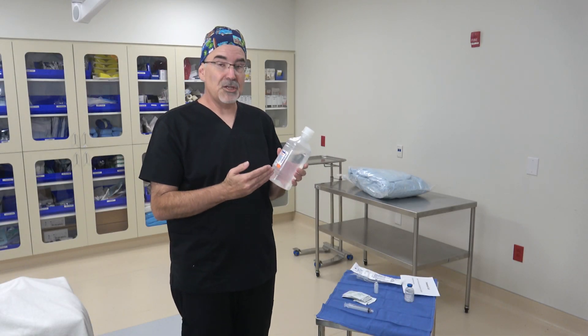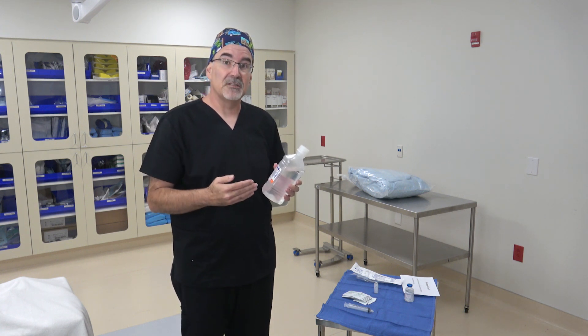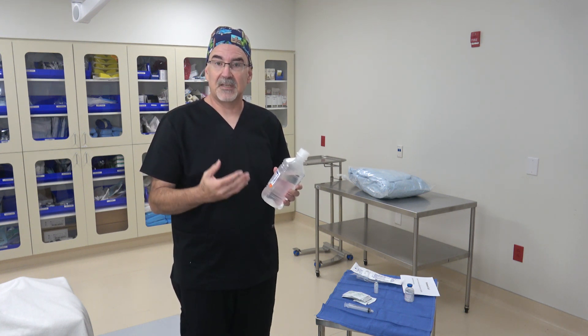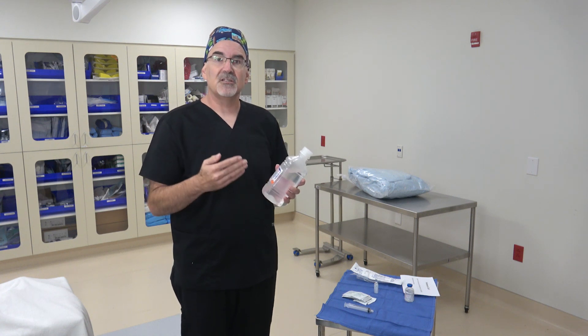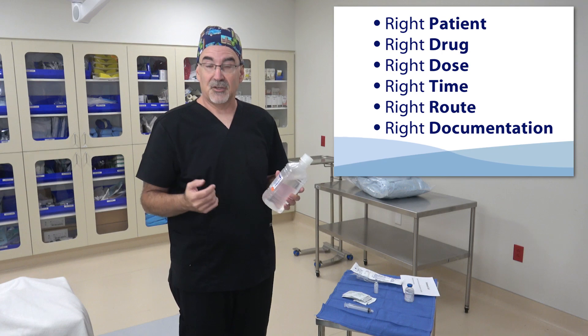Today, I'm going to show you how to receive irrigation onto your sterile field. Different irrigations can have different effects on the cells in your body, so we treat irrigation just like we do with medication, which means we follow the six rights of medication administration.